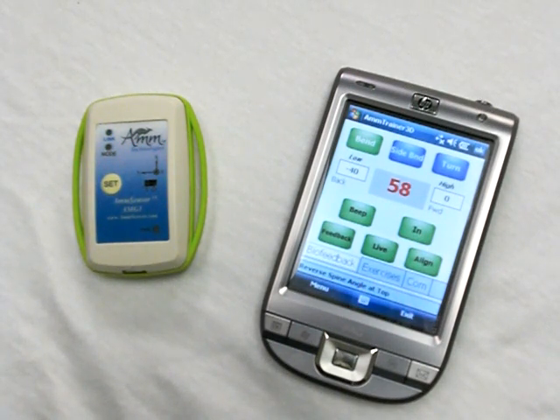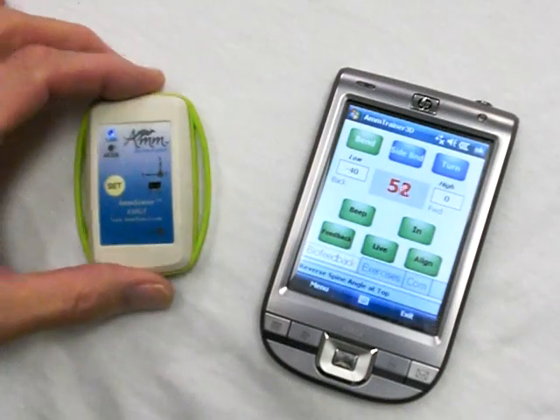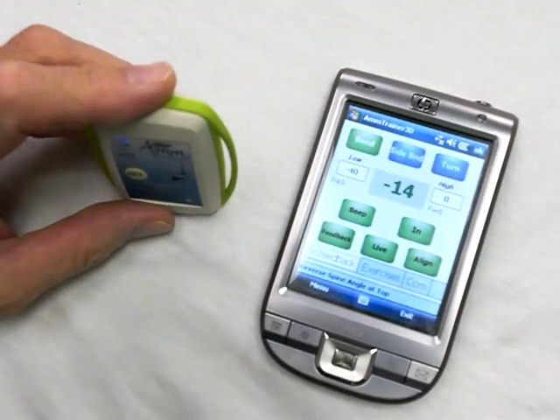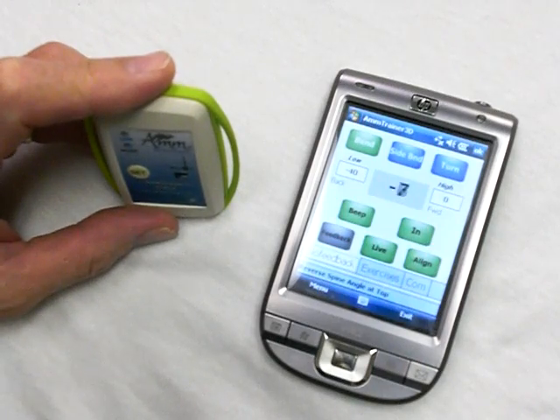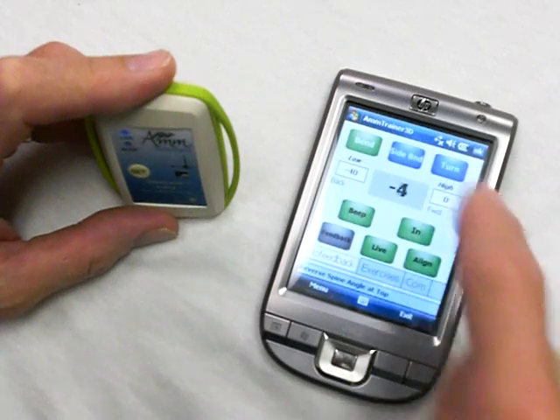Hi, this is Phil Cheatham, the 3D guy from AMM. I'm demonstrating our AM sensor and the AM Trainer 3D application running on a PDA or handheld PC, which is very portable, light, and small. The sensor is a 3D inertial sensor which allows you to measure different angles of the body. You can measure bend, side bend, and turn.